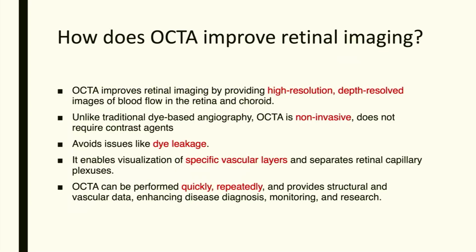So what is OCTA and how does it help you over OCT? We've seen that OCT already gives you a lot of answers. It is high resolution, and as the name suggests, we are talking of angiography now. The only angiography which we knew earlier was fluorescein angiography, and this is also an angiography, but how is it different? How does it help you more than a fluorescein angiogram? It is high resolution. It means it shows you much more detail than a fluorescein angiogram would do.